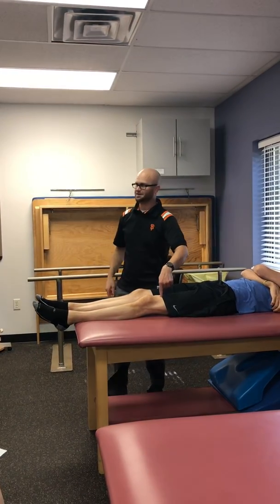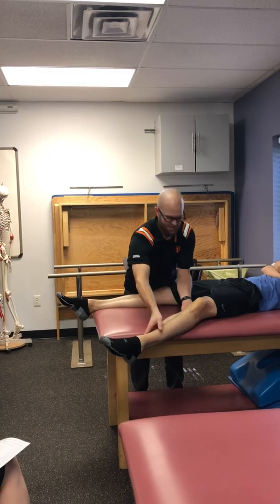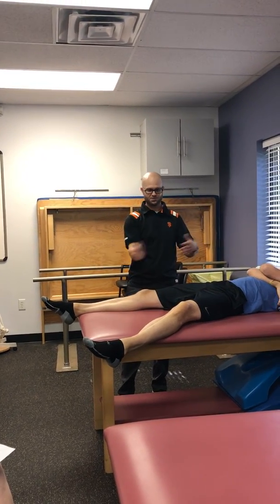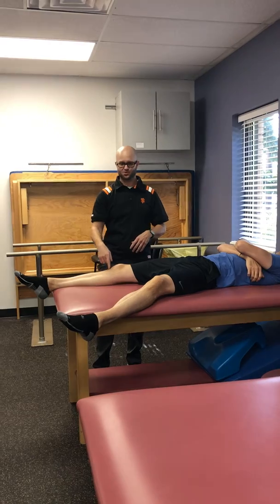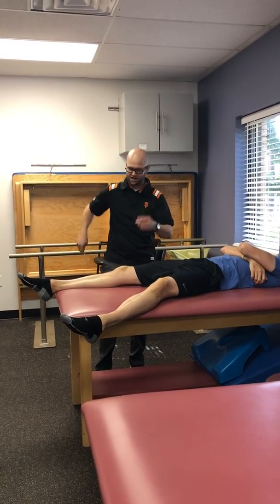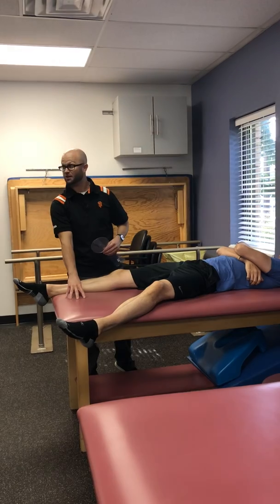Okay, so we know that abduction is going to be more than adduction, right? So now I can just have him move that leg out of the way, and I don't have to worry about it. If he's as far as he can go or close to it, I've only got 20 to 25 degrees that I'm going to be dealing with on this side. So I shouldn't hit that leg. Okay, so I just got it out of the way. And it makes it so that leg and movement is completely supported by the table itself.